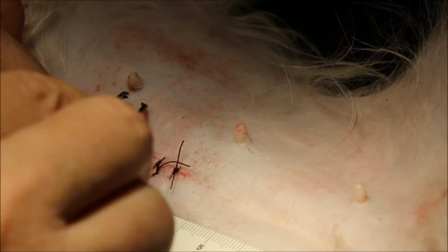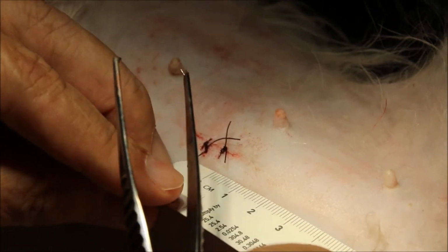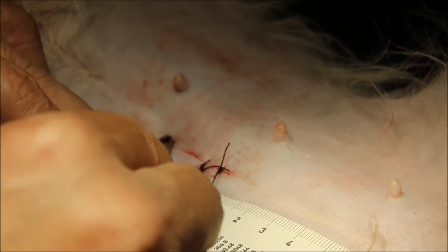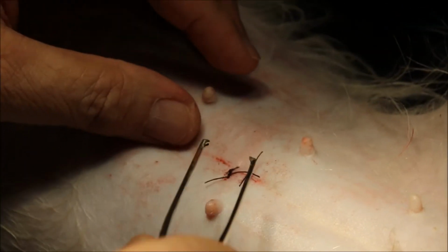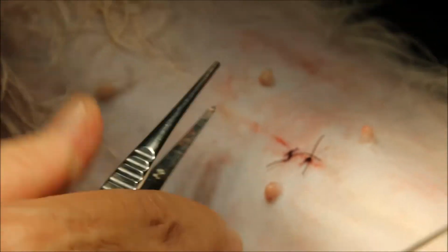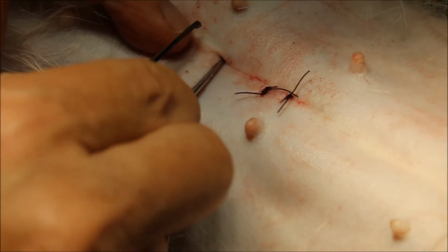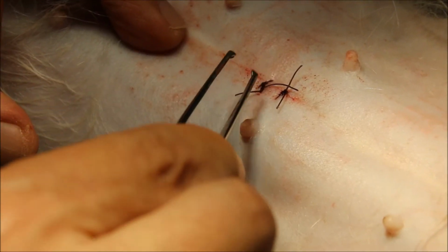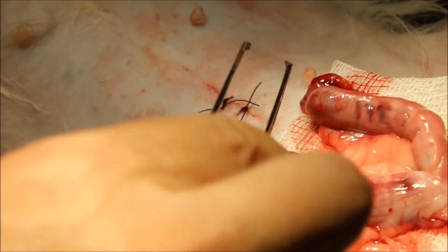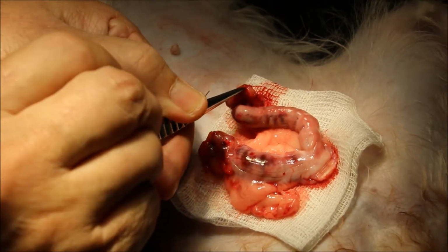Sometimes the ovary is so hard to tie because the incision is too far and the vet doesn't want to enlarge it. Normally you should enlarge the incision. You will find that the ovary is too far away and too tight, then you just increase the skin incision so that you don't put tension on the ovary. Because once you put tension on it, the ovary might just break.